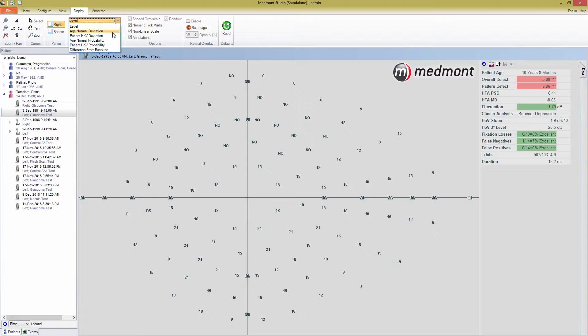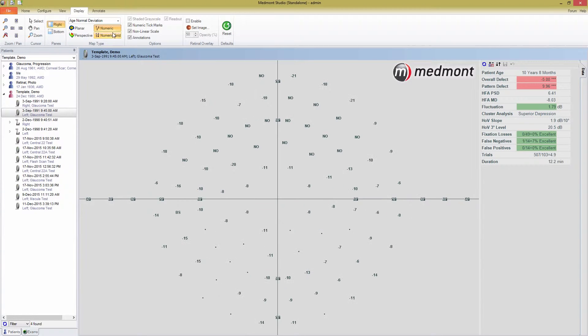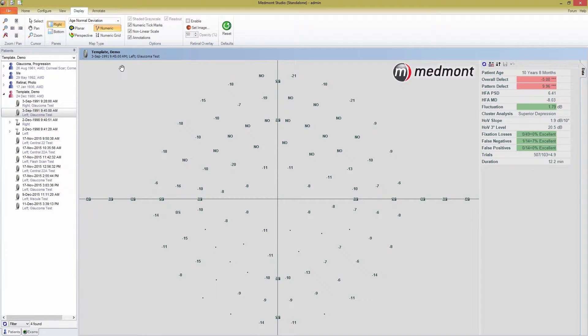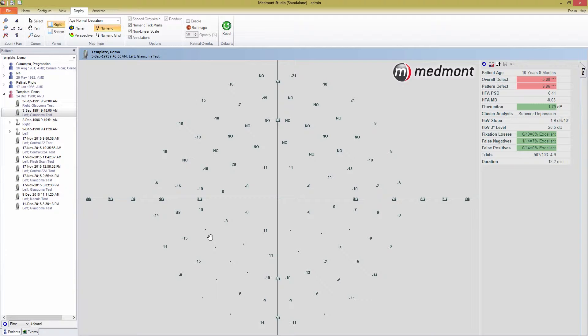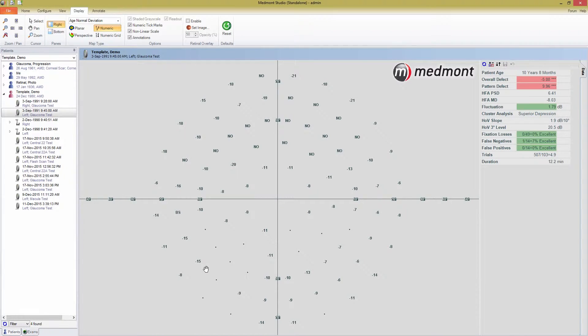This compares the patient's threshold result to the age normal hill of vision for a person in the same age group. Age groups are split into 1 to 45 years old, 46 to 60, and 61 years plus. If viewed in numeric view, a single dot indicates that the threshold at that stimulus point was within 6 dB of the age normal. A negative number is at least 6 dB below the age normal and quantifies how depressed the point is relative to what should be expected for normal vision. This display is an important tool for viewing overall field loss as well as large defects.